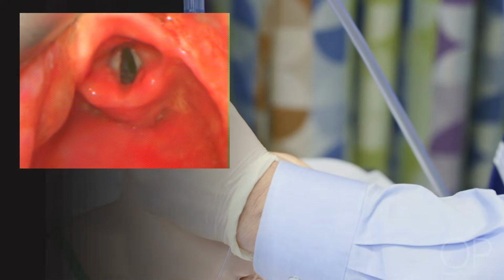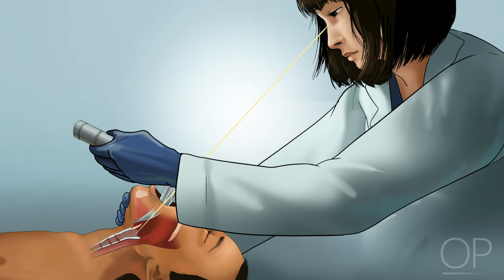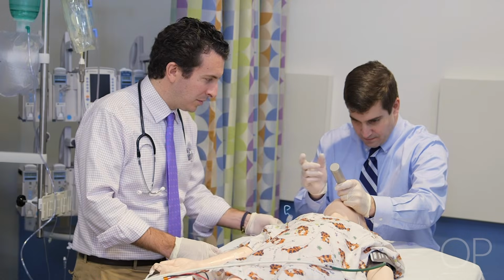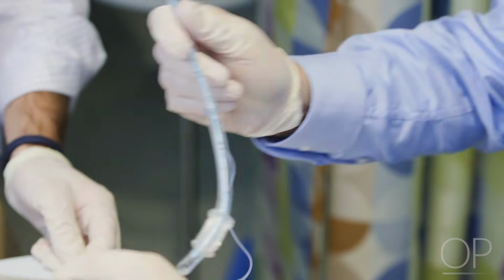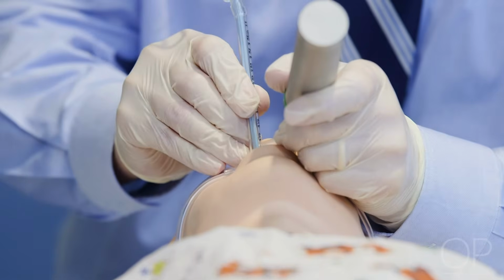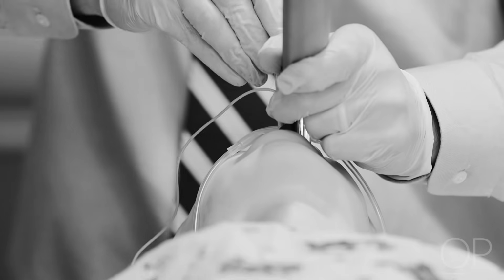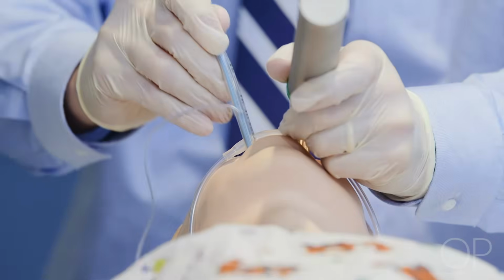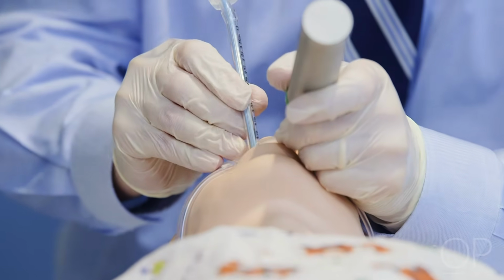Once the glottis and the vocal cords are visualized, the provider performing the intubation should maintain the laryngoscopic view. The endotracheal tube should be handed to the intubator by one of the other team members. The tube should be inserted from the right side of the mouth through the vocal cords using one smooth motion. Avoid insertion of the endotracheal tube down the barrel of the blade, as this will block the line of sight. The tube should be advanced into the trachea to the appropriate depth.